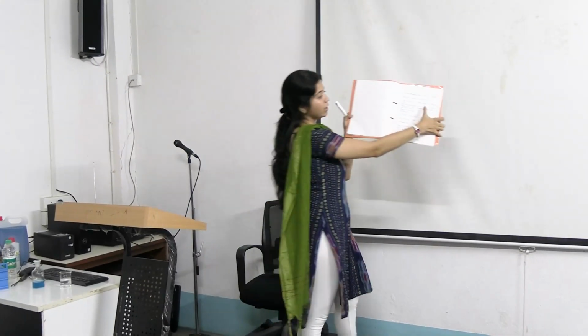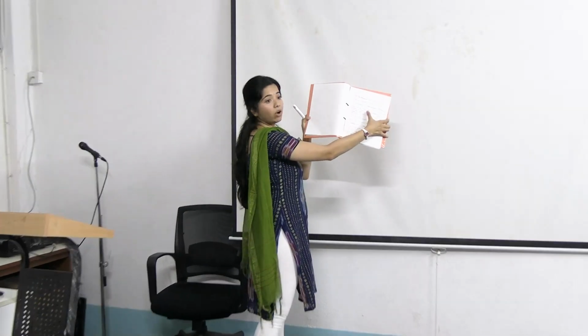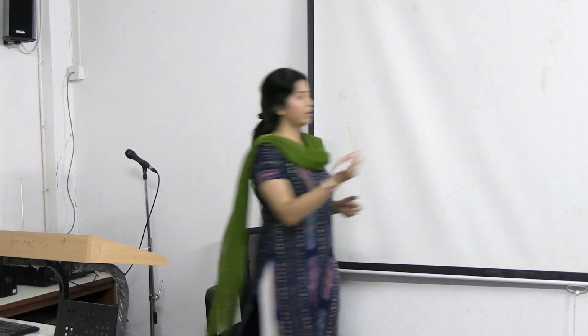In a practical book like this, there will be 3 columns, in qualitative tests only. In a quantitative test you have to explain everything: procedure, principle and all calculation. But in a qualitative test like the Benedict test, you have to make only 3 columns.